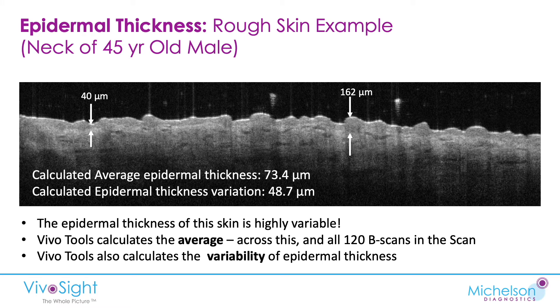Here's an example: the neck of a 45-year-old male with quite rough skin. You can see that the epidermal thickness is varying quite a lot, from 40 microns on one end to 160 microns on the other. The average epidermal thickness across the entire skin area is 73.4 microns, and the average variation across that whole area is 48.7 microns. This gives us a good idea of not only the average thickness but also how much that thickness is varying.